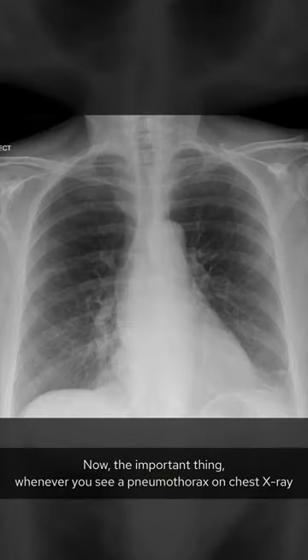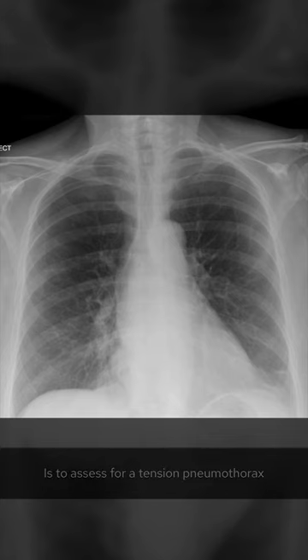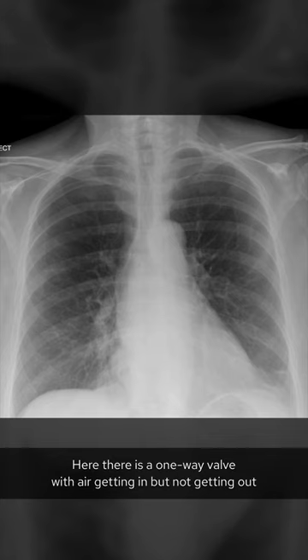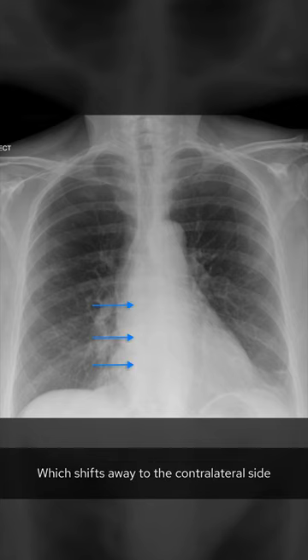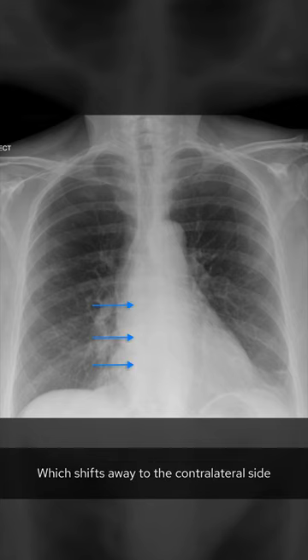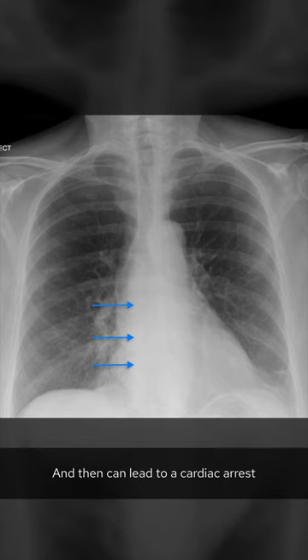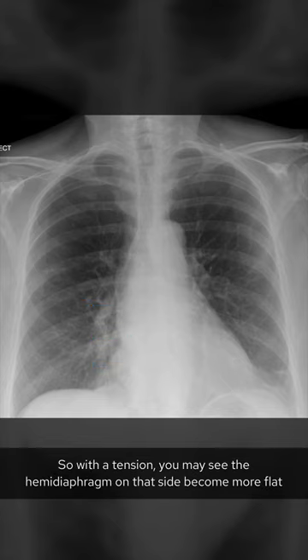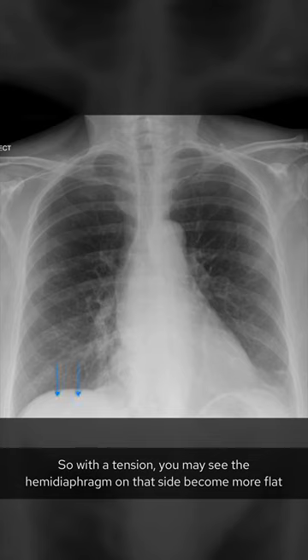Whenever you see a pneumothorax on chest x-ray, it's important to assess for a tension pneumothorax. Here there is a one-way valve with air getting in but not getting out. This produces a pressure effect on the mediastinum which shifts away to the contralateral side, and inevitably leads to arrhythmias and can then lead to a cardiac arrest.